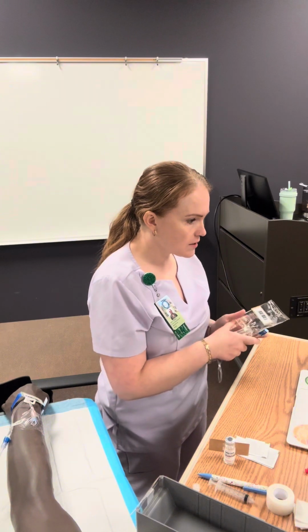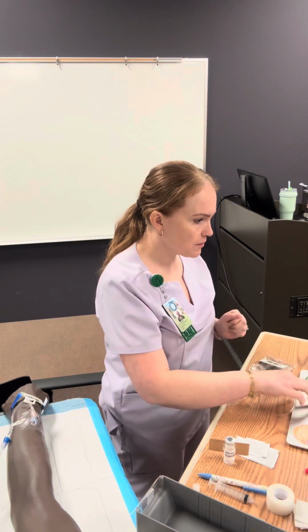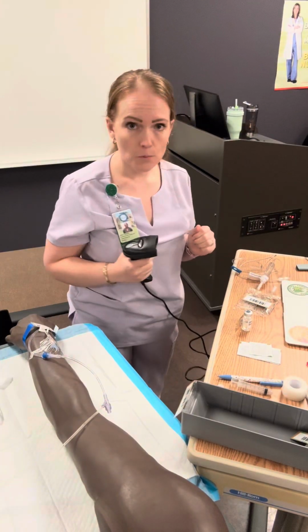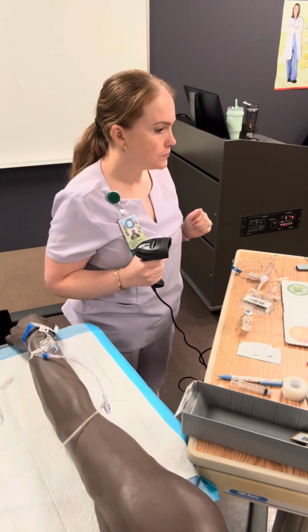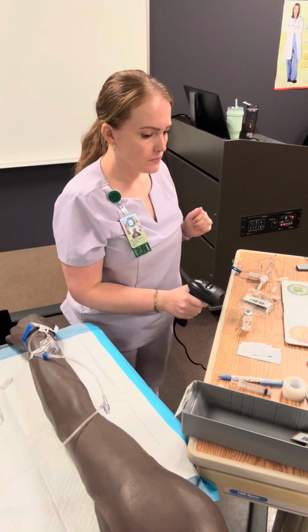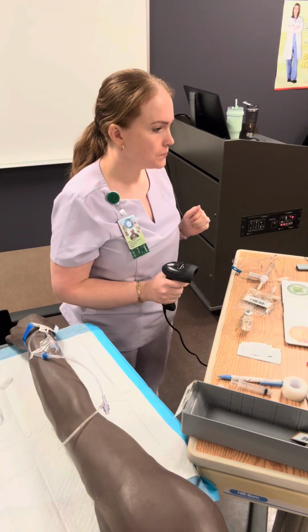I'm going to go ahead and scan the patient's wristband. Okay, we are going to scan the wristband. Scan the medication.